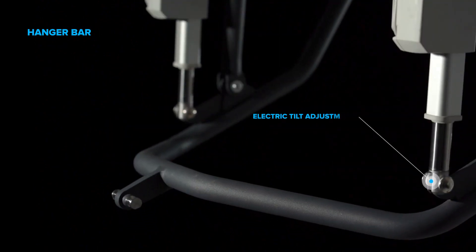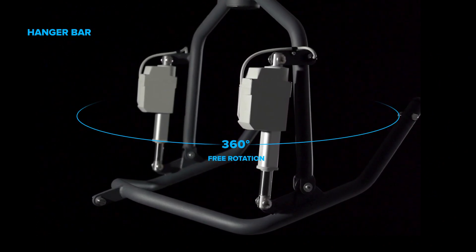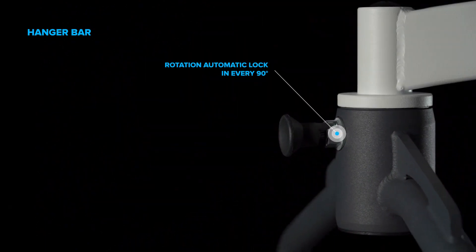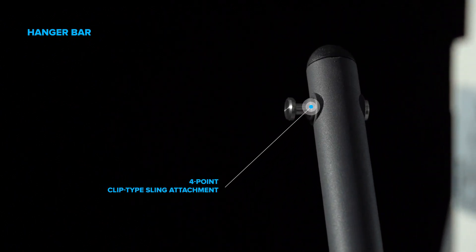Hanger bar electric tilt adjustment. Full 360-degree rotation with hanger bar rotation lock. Four-point clip-type sling attachment.